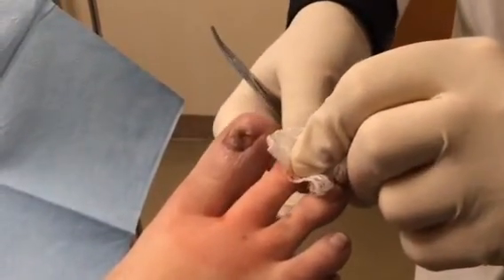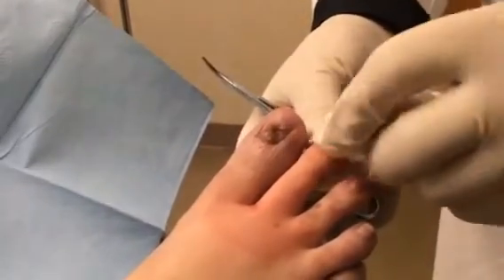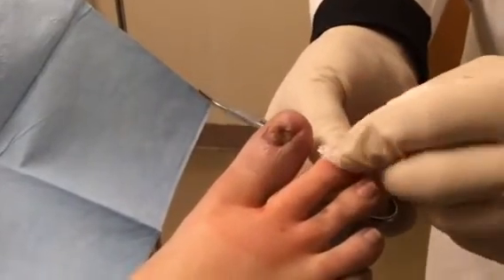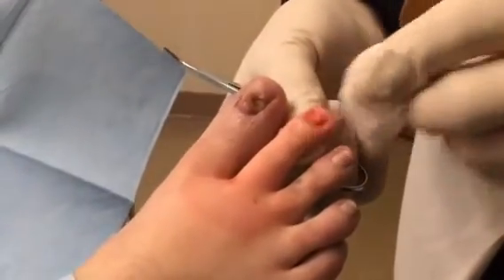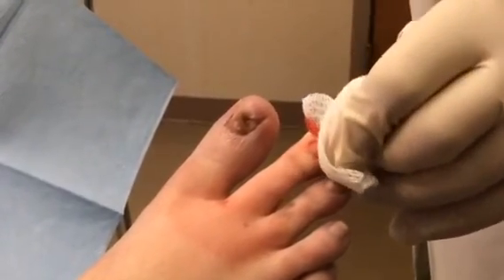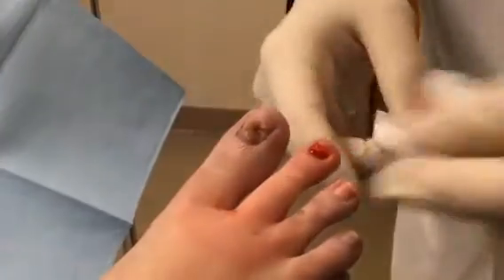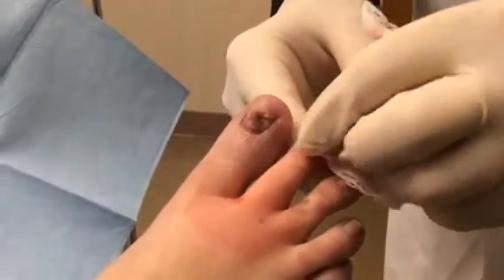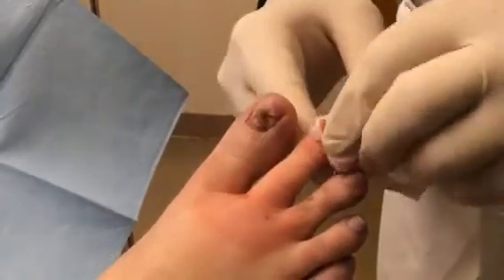So we're going to go ahead and bandage this up — it'll be a kind of a big bandage, like on our permanent nail removals. The exception being it should only take a week or less to heal, as opposed to a permanent removal which takes about a month. We're going to put some cream on this, some antibiotic, a big bandage including some Telfa, which is so that it doesn't stick. That's really important because if you put gauze directly on it, when you go to remove it, it's going to stick. We'll see how this one does in a few weeks and get that dead skin taken care of on that one.